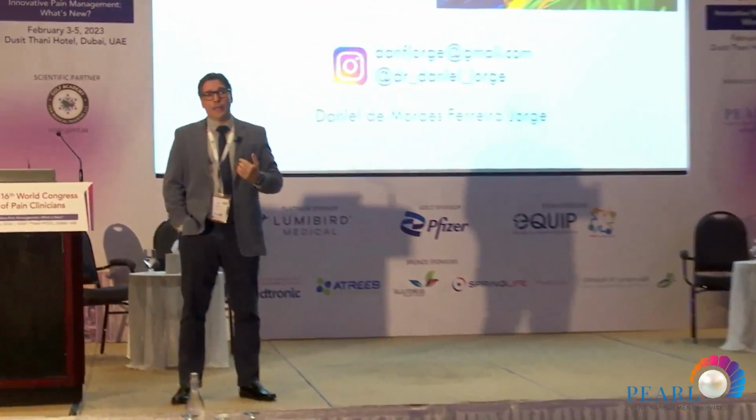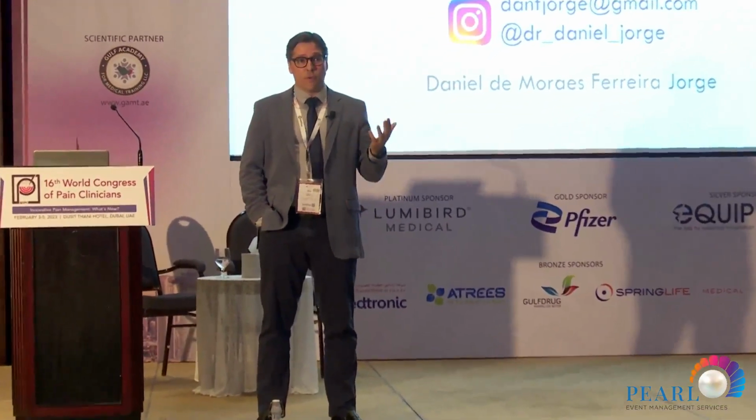Oh, okay. Professor Schwab will show you, but I used to use those kinds of parameters and adjustments that I showed you. Okay, the voltage and duration of pulsed radio frequency, this factor affects the effectiveness of radio frequency. There are a lot of factors. Actually, we don't have a standardization of that yet. I used to choose depending on how painful the patient is or not, and the grade of the osteoarthritis involved.